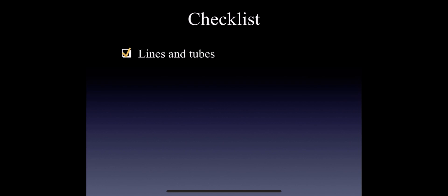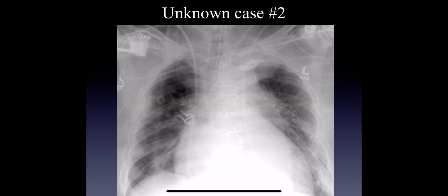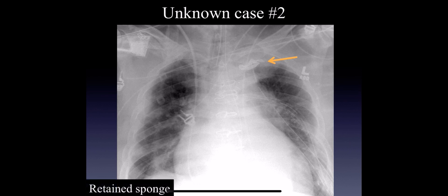So number one in the checklist: lines and tubes. Look at lines and tubes on every single case. This next patient has had a sternotomy, and they have an endotracheal tube, a nasogastric tube, a pulmonary artery catheter, chest tubes, clips, and some pulmonary edema. It's very easy to miss through all that noise this structure — the radiopaque marker of a sponge. So foreign bodies: I think radiologists are really excellent at subtracting out things that are overlying the patient, like EKG leads and big metal pads, and we're so good at it that sometimes we even subtract out things that aren't supposed to be there — foreign bodies that are in the patient. So in every post-operative case, I force myself to look very carefully for these because they can be very subtle.